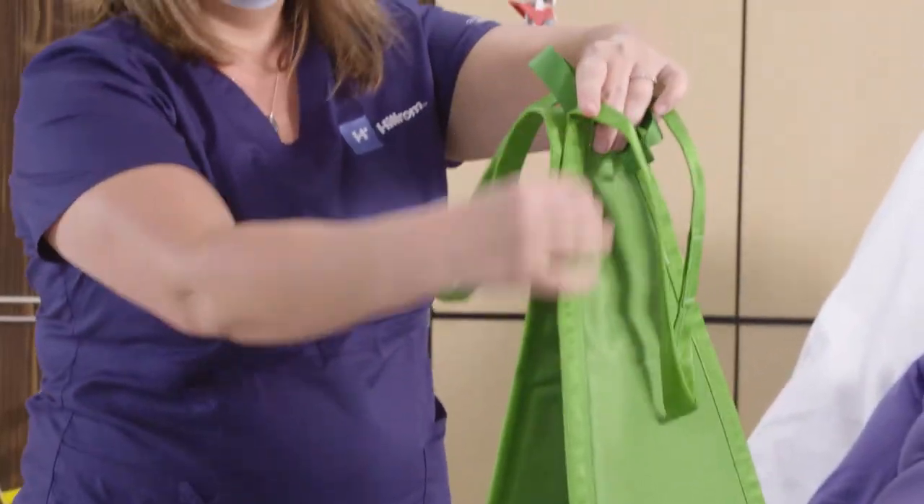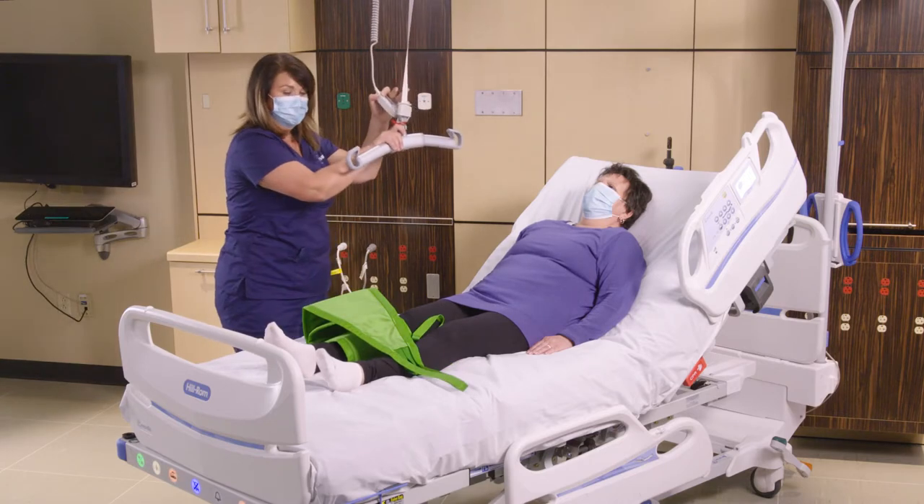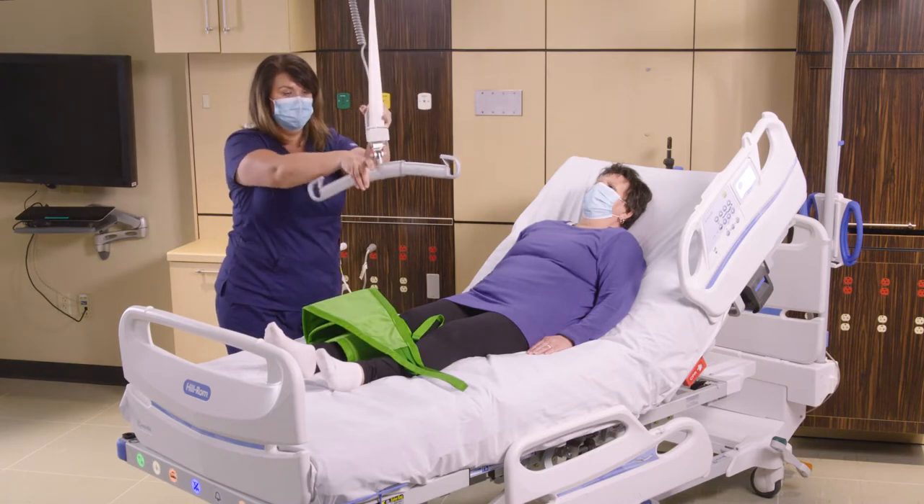We want to make sure that the Multi-Strap is even on the left and right, and then we can go ahead and get our sling bar. This can be used on a Golvo, the Viking, and the overhead lifts.